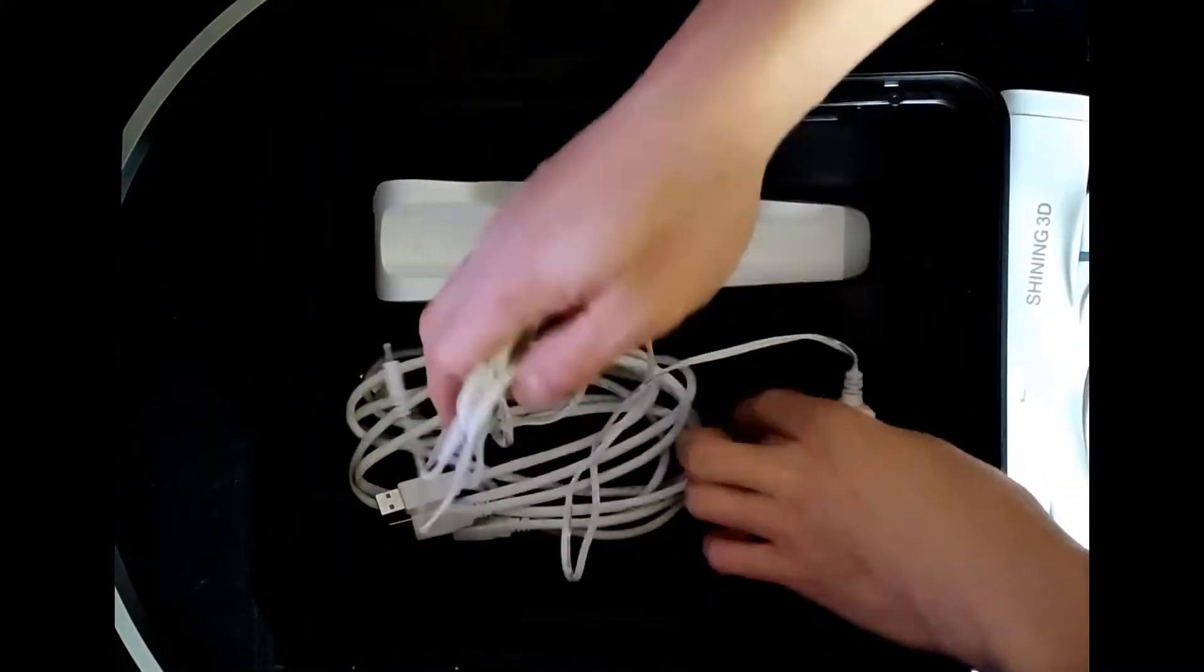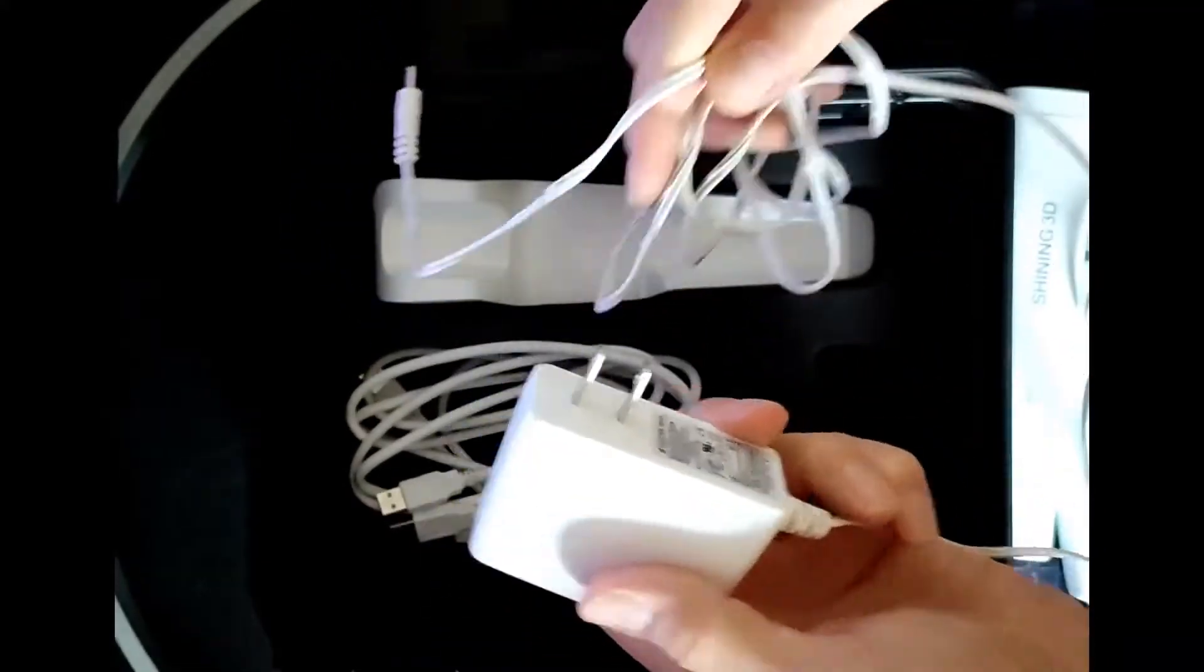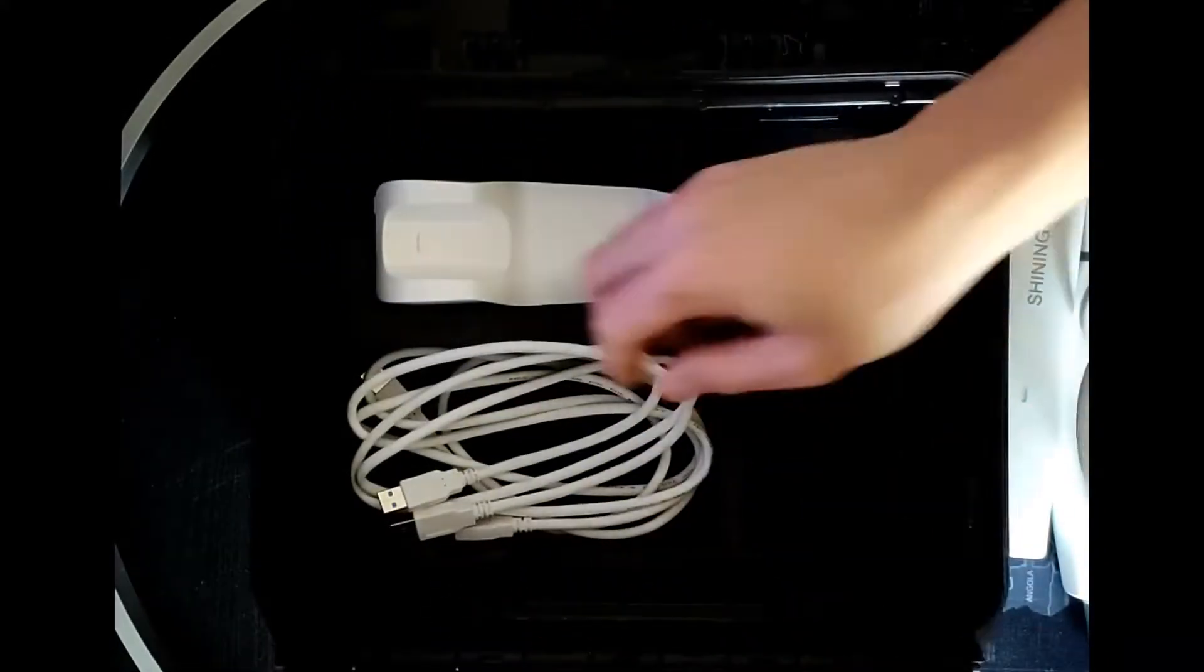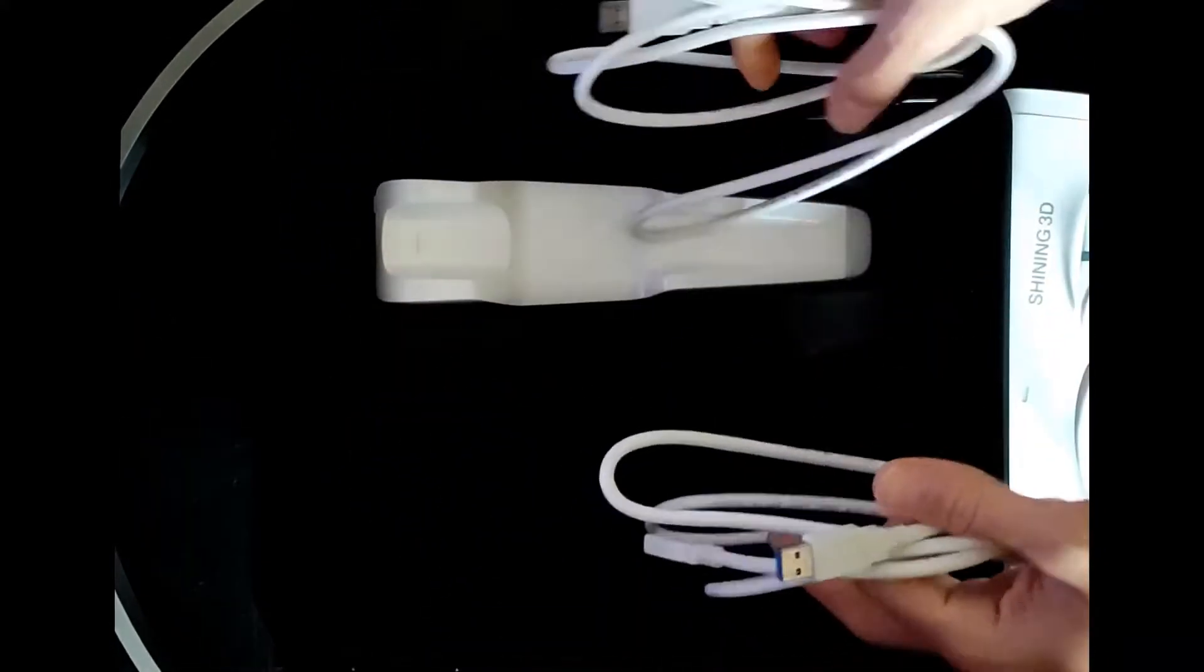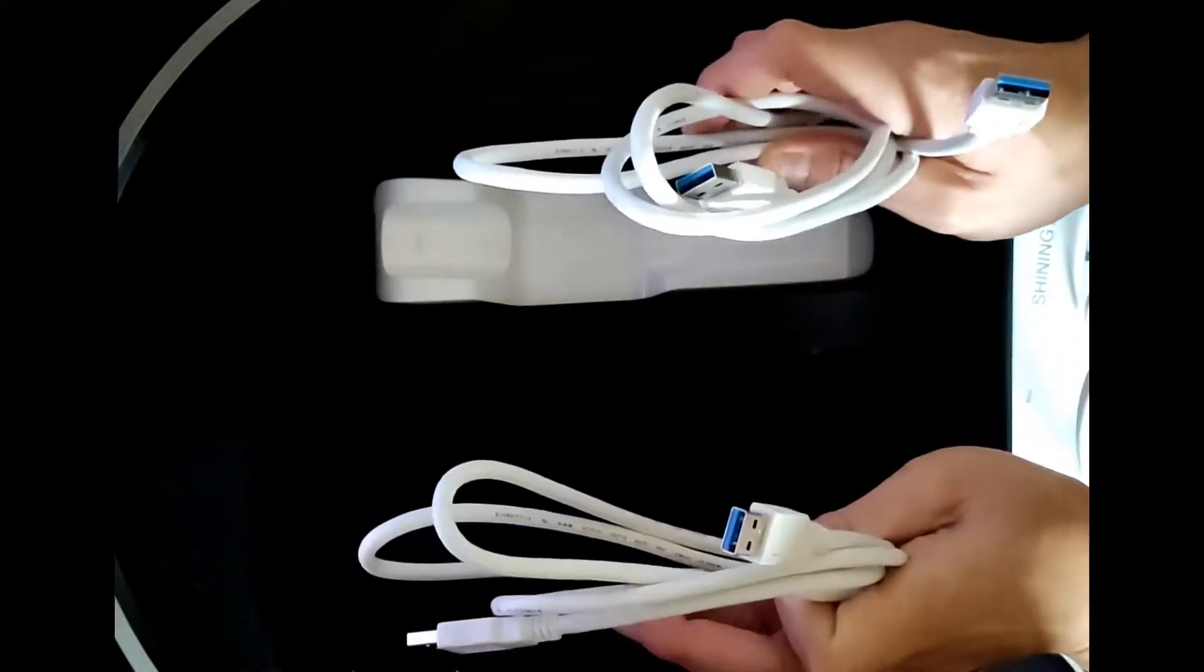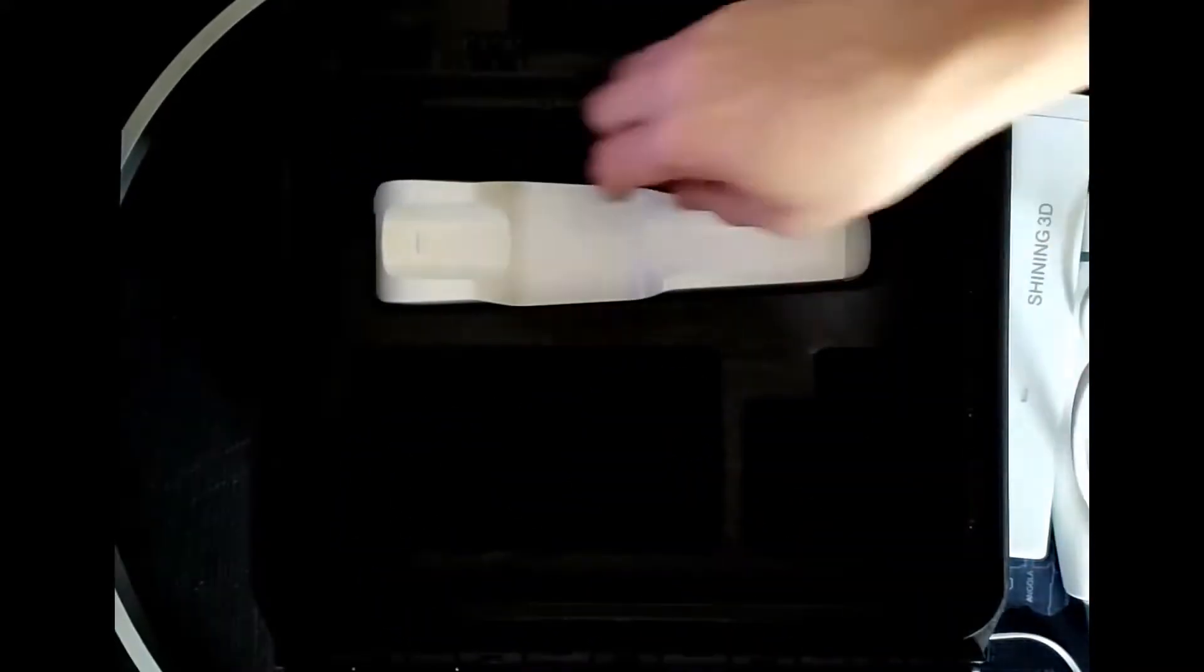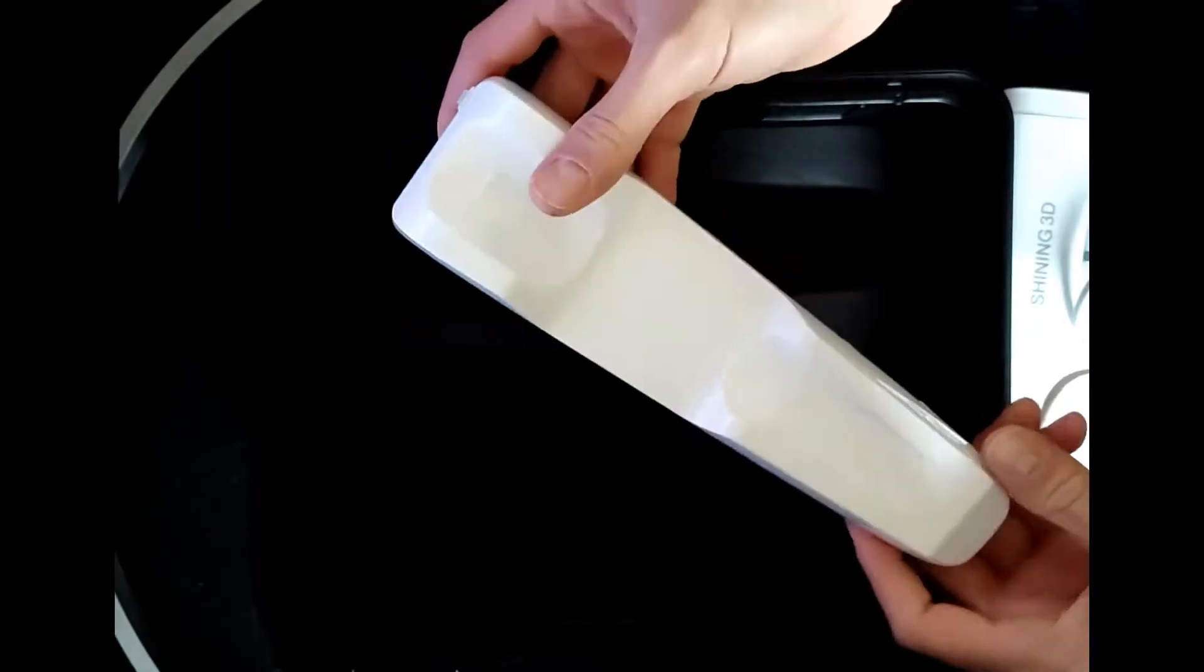Moving the first protection, in the second level of the box we can find the power adapter, two different USB cords and the scanner base.